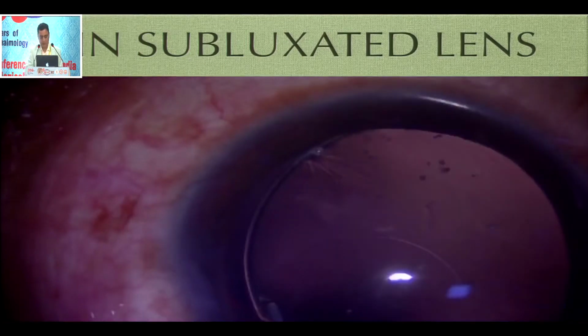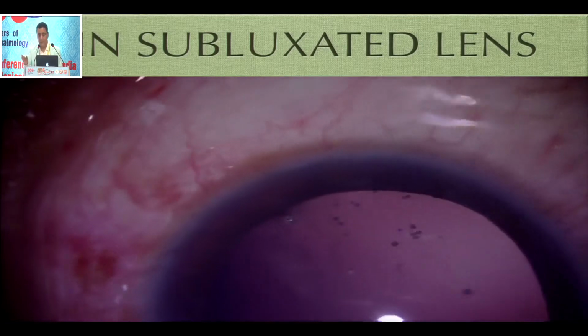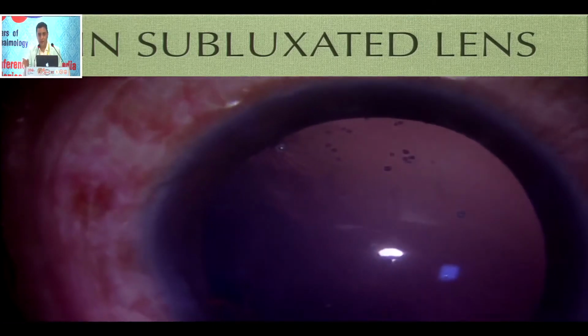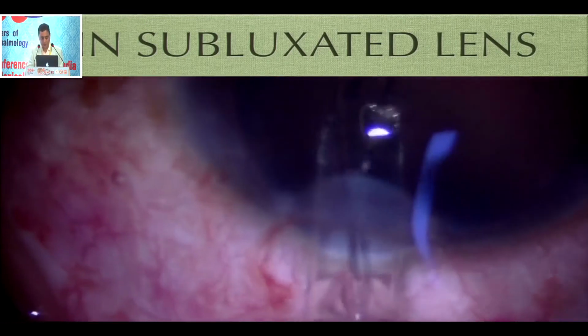I go ahead and put an endocapsular ring. That stretches the bag out quite well. And now I put the lens, and when the lens is put inside a decentered rhexis, the lens will center in the center of the bag, okay? So this is one more important information.